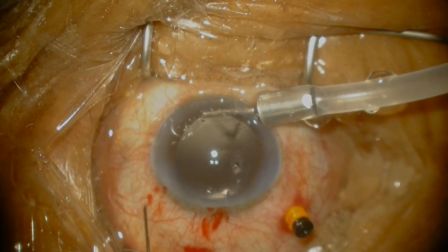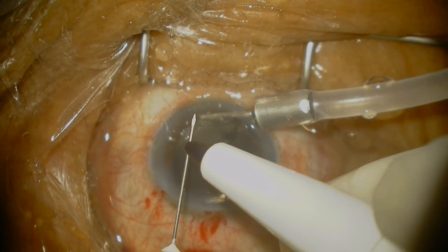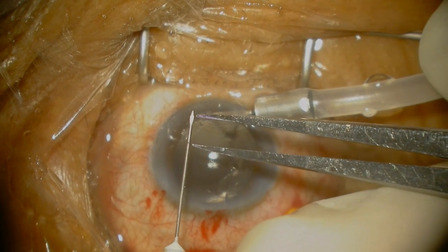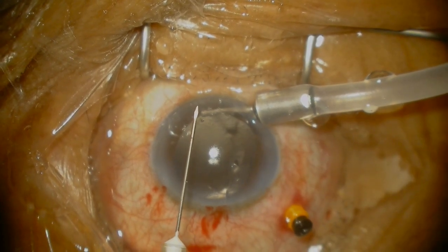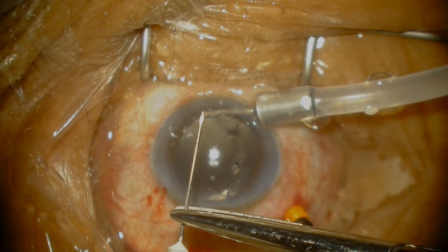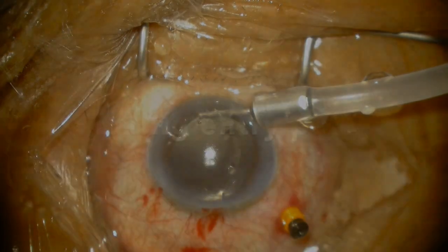The needle is bent about 2mm from the hub and about 70 degrees. My next tip is on bending the needle — 70 degrees should create a good position for your hands to actually enter the eye ergonomically. Some people like to use the needle attached to a syringe; I prefer to just hold the needle hub.